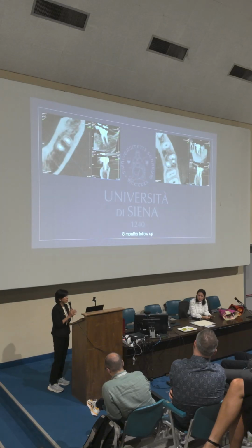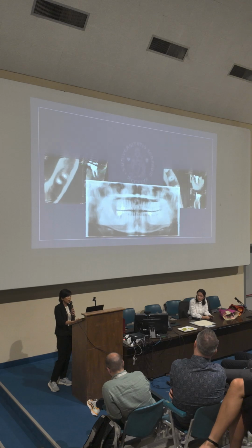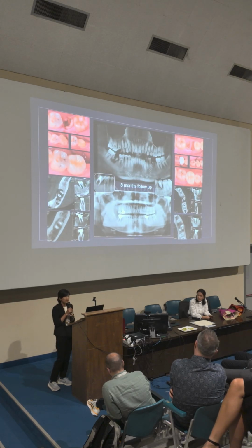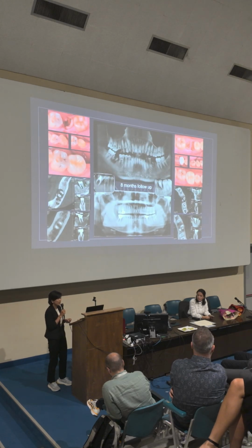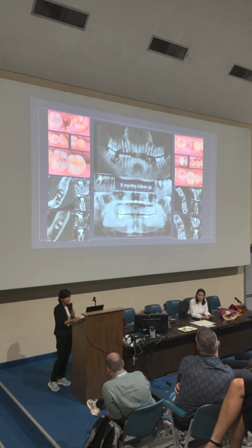And you can see this is the 8-month follow-up CBCT now. And you can see the bone is healing. The bone is regenerated. And this is the panoramic. And you can compare the clinical image and the radiographic image preoperative and after 8 months follow-up.